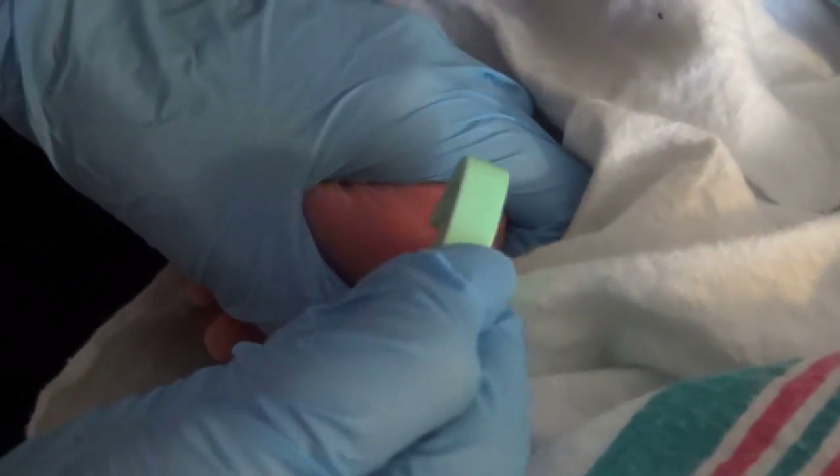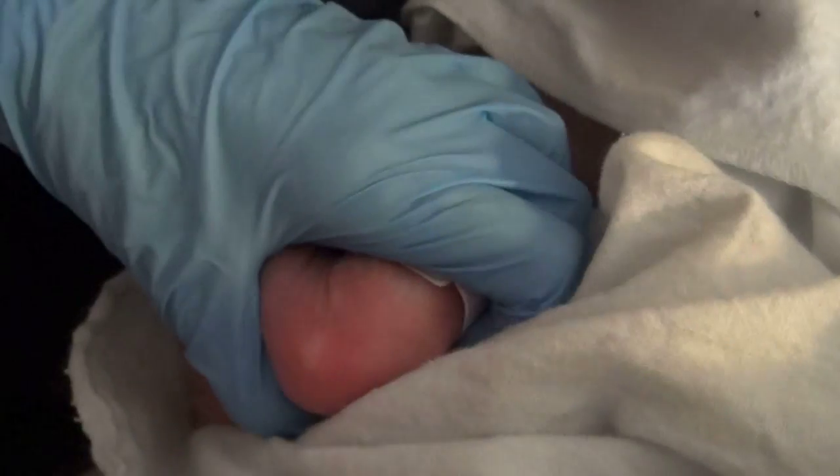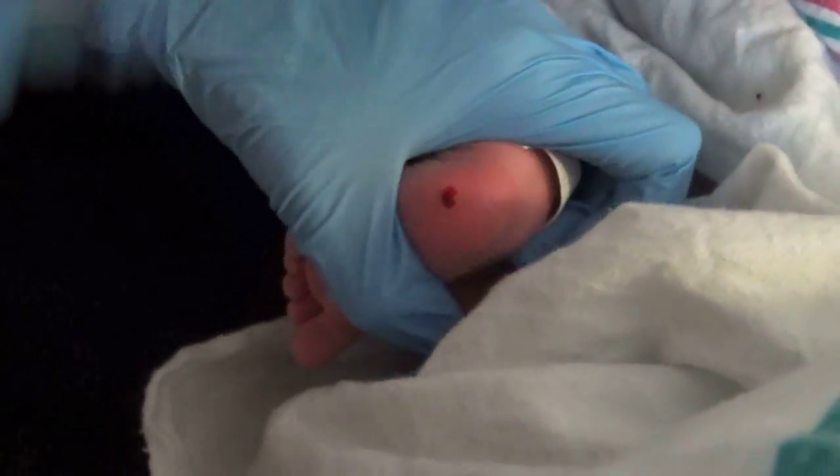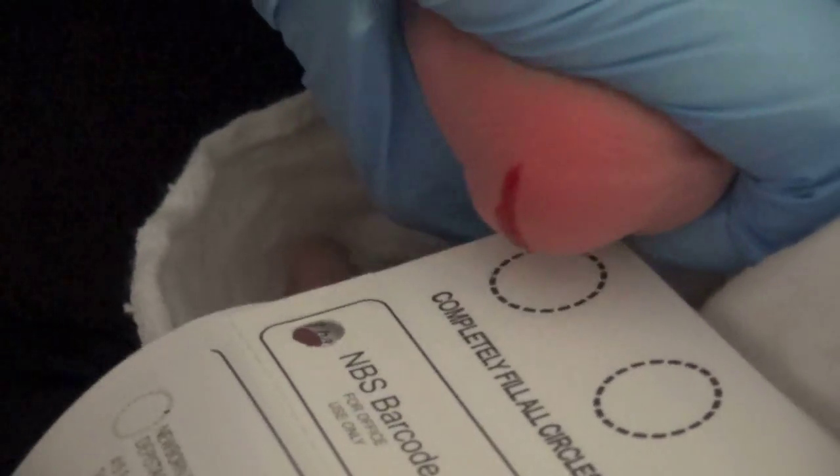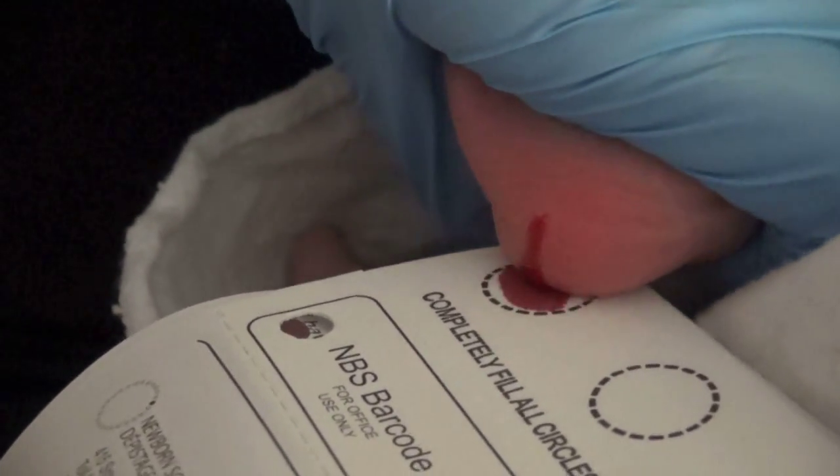Firmly encircle the heel area with your hand. Puncture the heel with the lancet. Wipe away the first drop of blood with gauze. Allow for spontaneous blood flow using gentle pressure without excess squeezing.